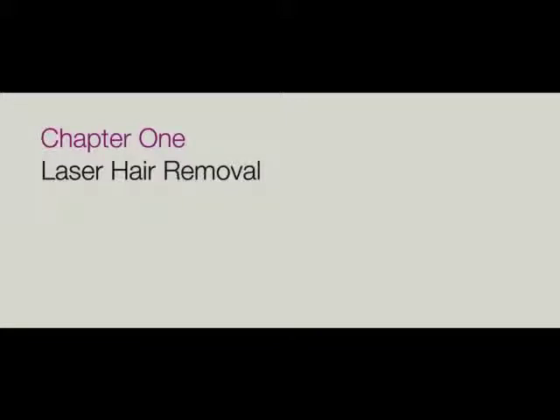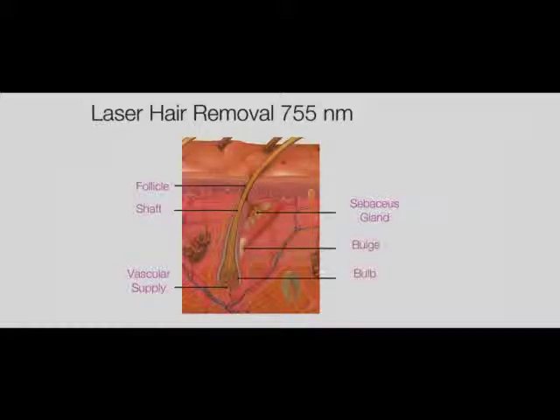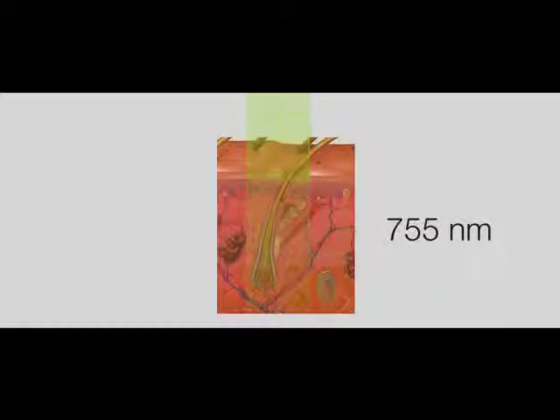Chapter 1. Laser Hair Removal. The 755 nanometer wavelengths are excellent choices for laser hair removal. The 755 nanometer wavelength has a strong affinity for the melanin in the hair shaft, which transmits heat to the bulb and the bulge of the follicle.